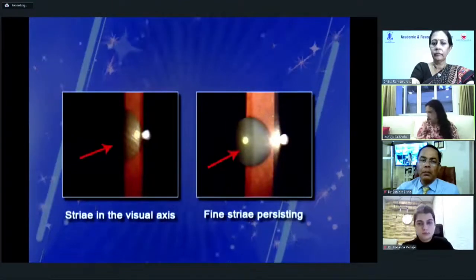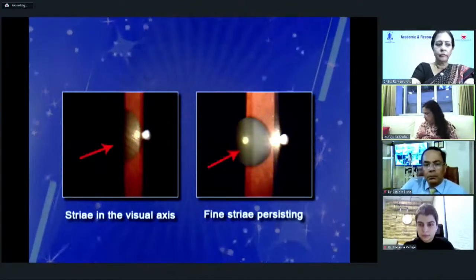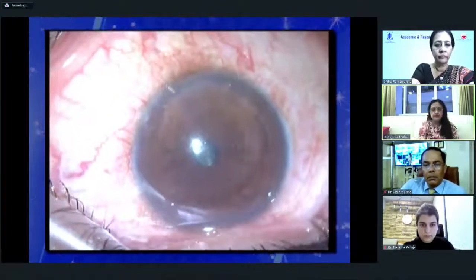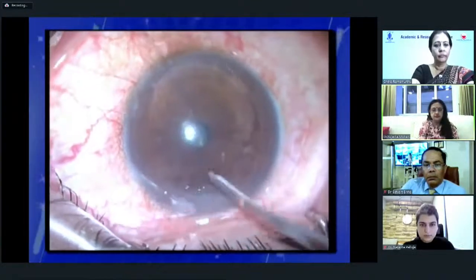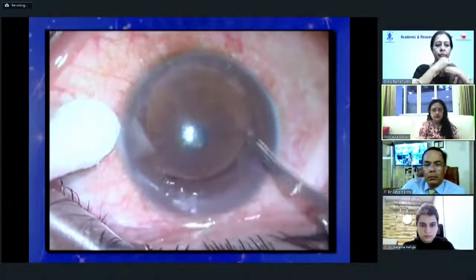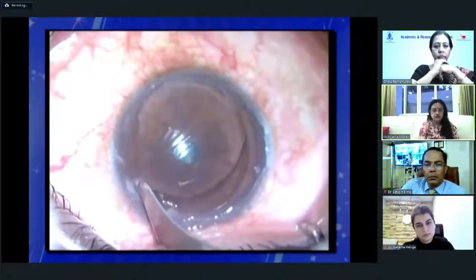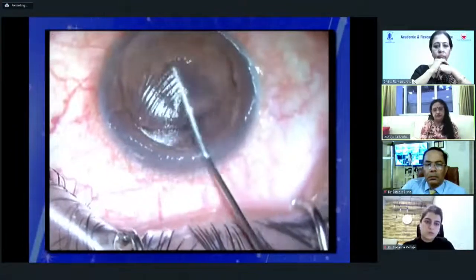The post-operative photo shows a clearing of the macrostriae with significant visual improvement. The second case presented on the third post-op day with flap slippage and flap folds. Here, the stromal bed is exposed with epithelial ingrowth. In this situation, the epithelium over the exposed bed is meticulously removed with a hockey stick knife before lifting the flap. The flap is lifted.